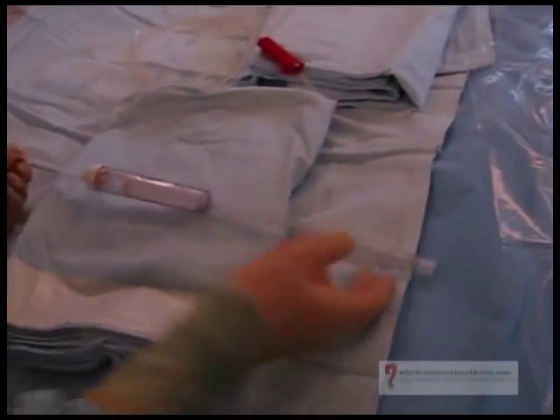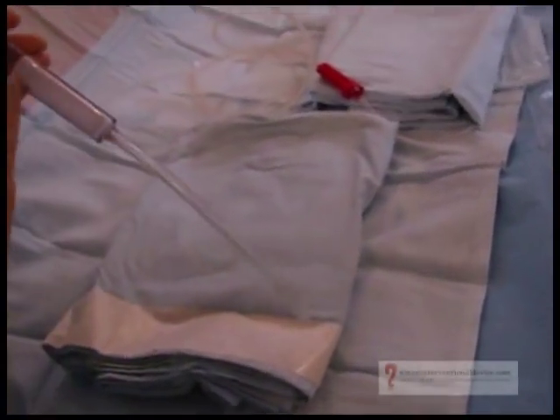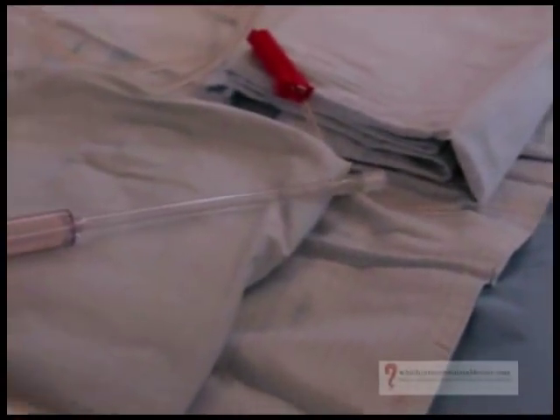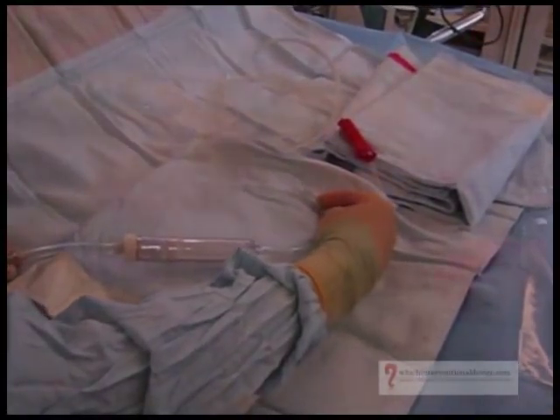This is the extracorporeal filter — the porous polyurethane membrane in here. This is the venous end and that's the arterial end. The blood is being filtered through this cup-like filter and returned to the patient's femoral vein.